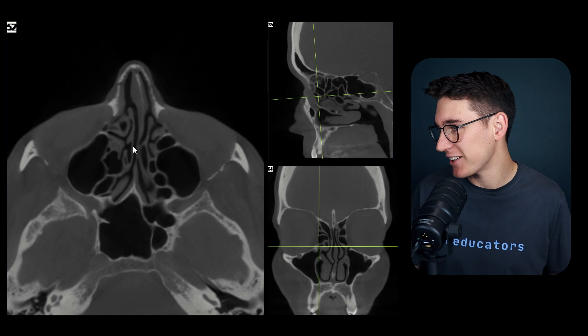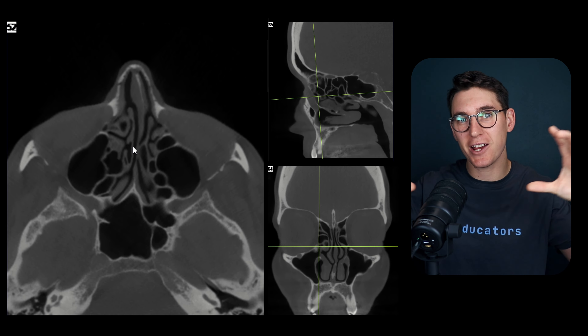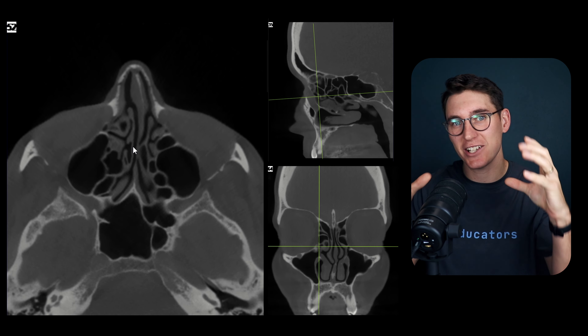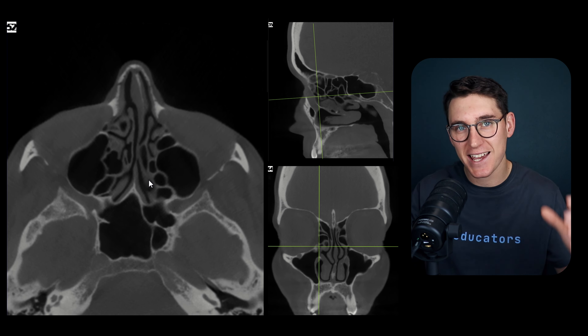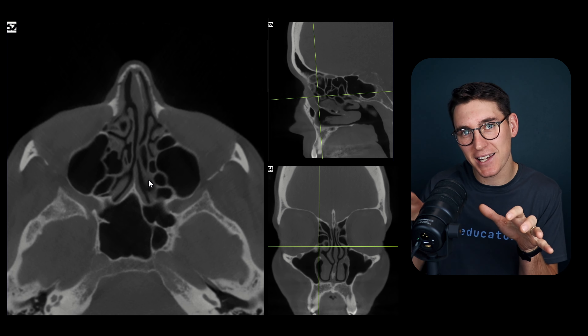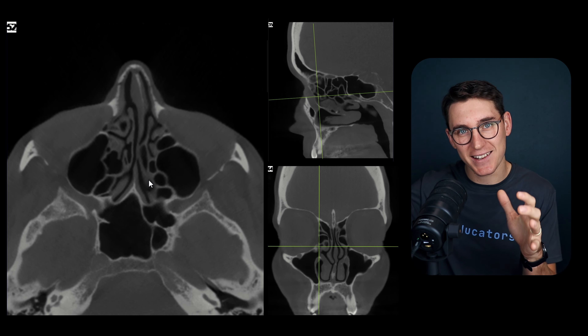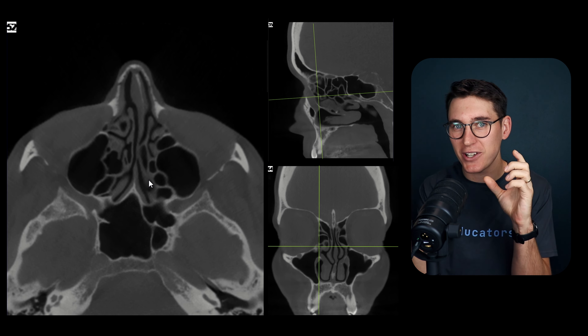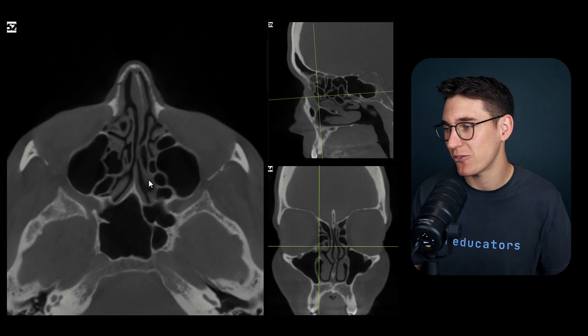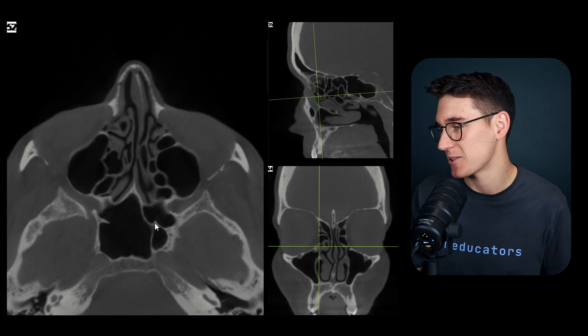The lacrimal bone interacts with the frontal process of the maxillary bone at the lacrimal maxillary suture. Posterior to the lacrimal bone is the ethmoid bone's lamina papyracea, making up the rest of the medial border of the orbit. That covers the superior and anterior facial bones. Now let's look at the palatine bone and sphenoid bone and how they create unique facial structures.